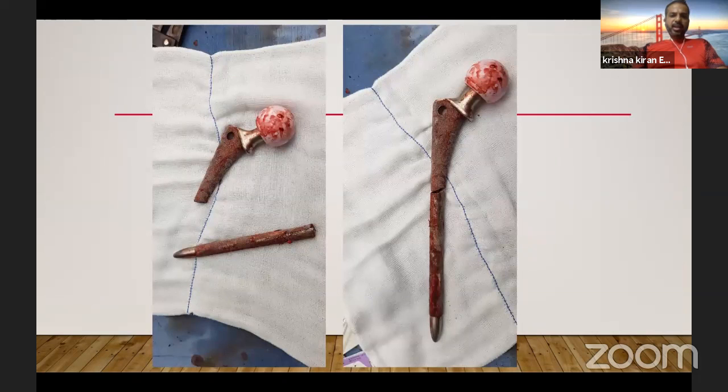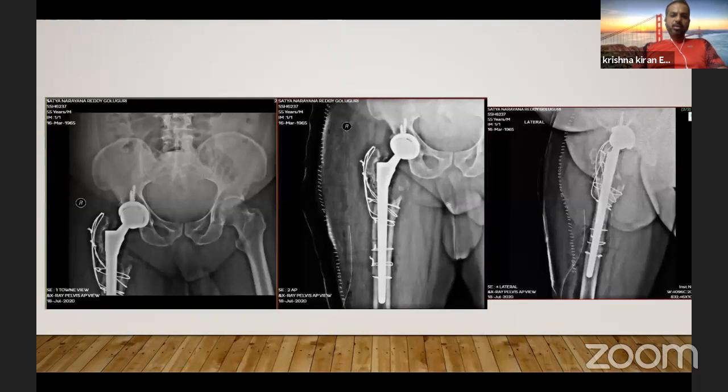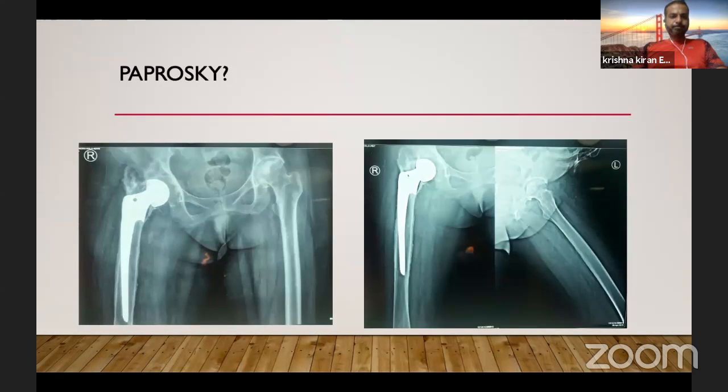So this patient we had to revise. There's no choice in these patients but to do a transfemoral approach, and the revision can become a little bit messy. But with the use of a monoblock Wagner, we are able to salvage even this difficult situation with a 265 stem. So we still have a 305 option available for this patient as and when he comes back for a subsequent revision. He's only 55 years old.